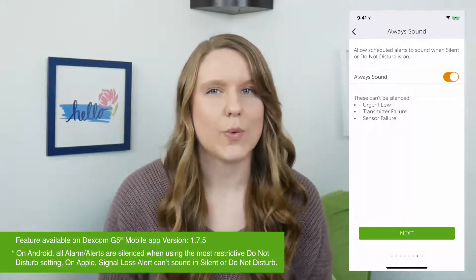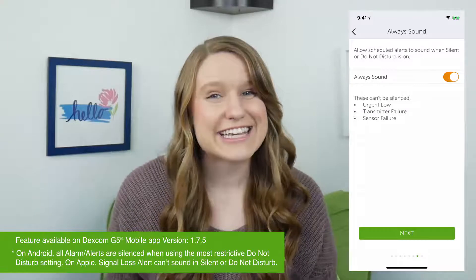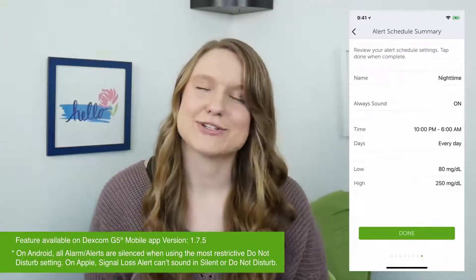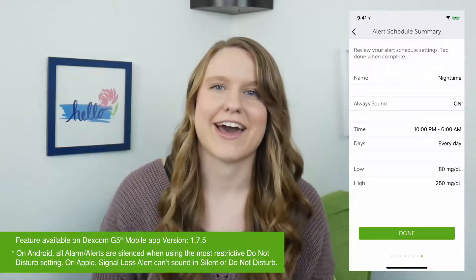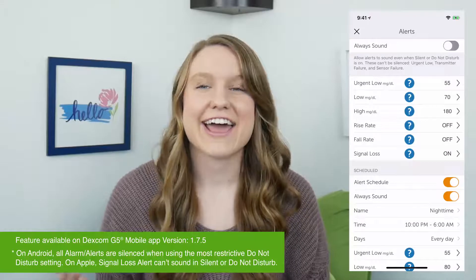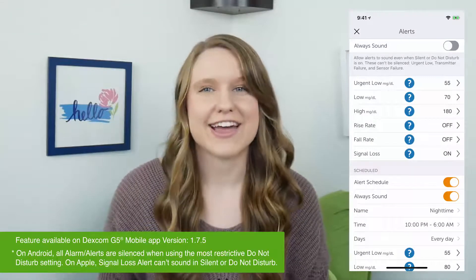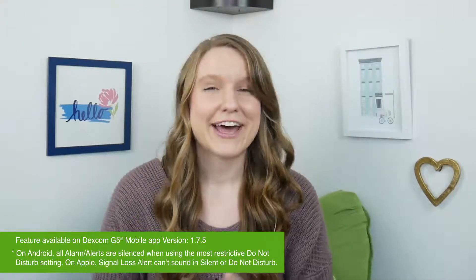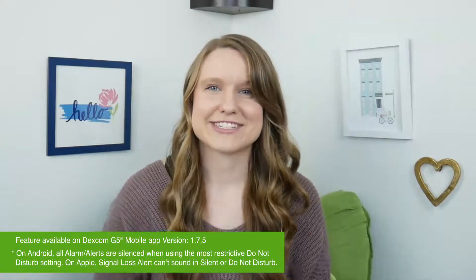I then choose to have always sound on, because I like to keep my phone on do not disturb at nighttime but I still want to hear my high and low alerts. During the day, I have always sound off so that my high and low alerts follow the default setting on my phone. I keep my phone on vibrate, so my high and low alerts vibrate.